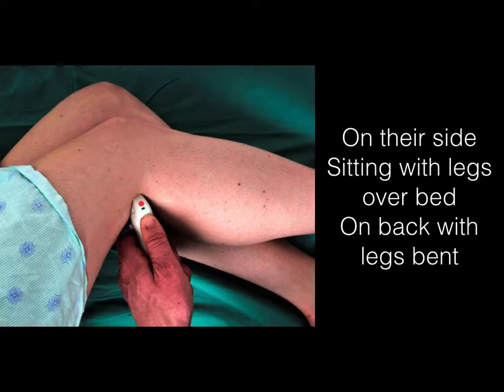If you have their legs too bent at times, what can happen is that the semitendinosus and semimembranosus, or the hamstrings, can get in the way, and your probe can want to roll off to the side. Just be cognizant of that and be aware that you might need to extend or flex their leg a bit just so that as you're compressing, things aren't moving off.